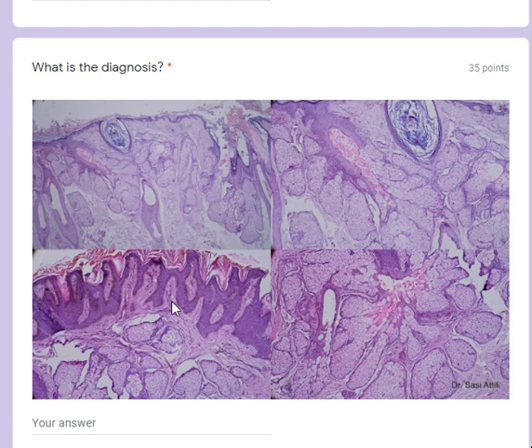Now, how do you differentiate this from an epidermal nevus? An epidermal nevus typically, to be honest, actually all of these are part of the same spectrum. These are called organoid nevi. So epidermal nevi, sebaceous nevus, a Becker's nevus, for example, a comedonal nevus, all these probably come under the same spectrum. So these are organoid nevi, organoid proliferation of normal skin units.